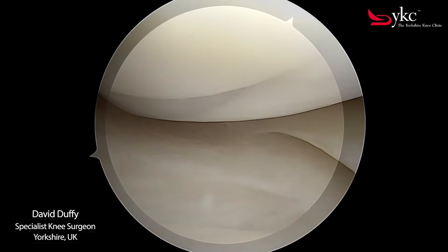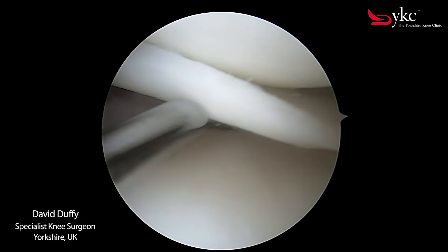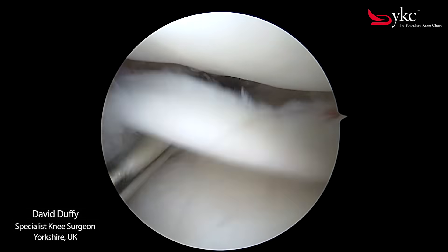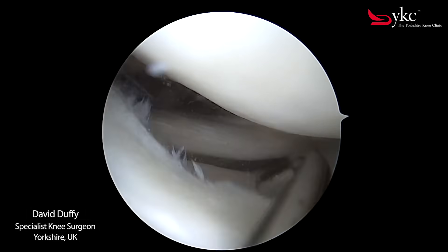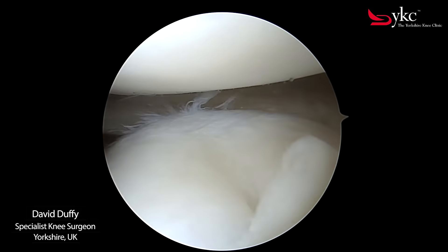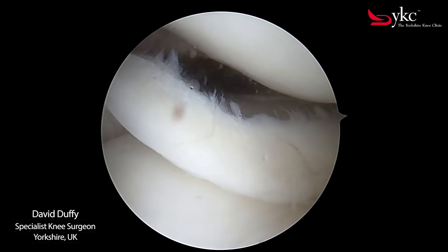The meniscus is one of the most commonly injured structures within the knee, often described as a cartilage tear. In this case I have identified a torn fragment that has become displaced. This can cause significant pain, catching or locking of the knee, limiting the function of the joint.